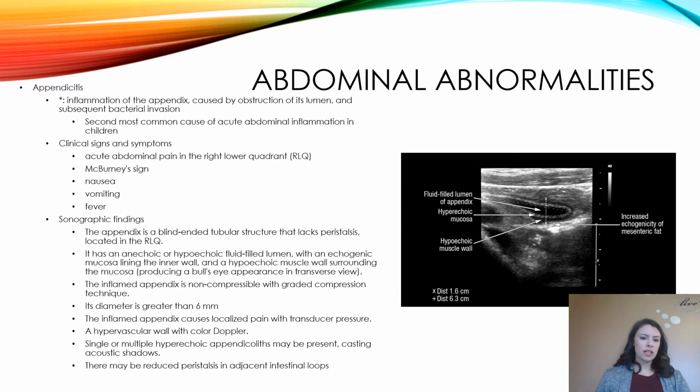Some ultrasound findings: the appendix is blind-ended or blunt-ended, and it lacks peristalsis, and it's located in the right lower quadrant. It has an anechoic or hypoechoic filled lumen, with an echogenic mucosa lining the inner wall and a hypoechoic muscle wall surrounding the mucosa. This gives it a bullseye appearance in the transverse view.